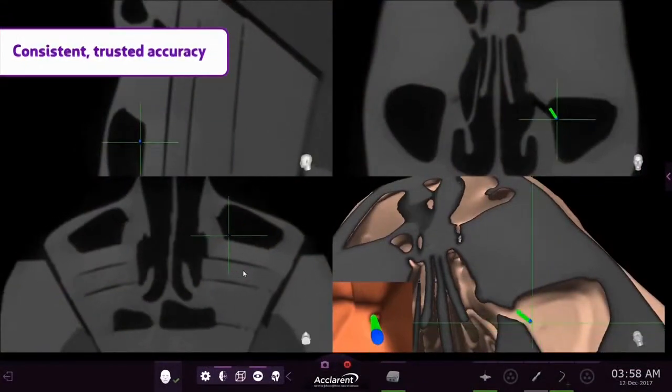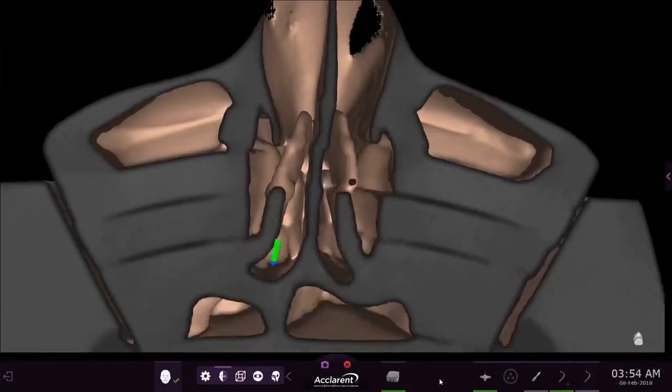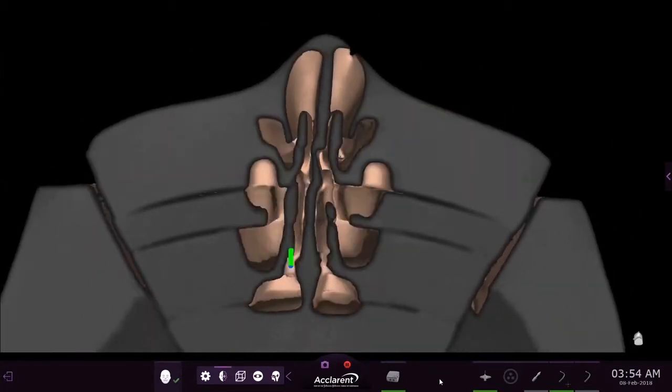So you know the normal anatomy. You've got an instrument that will guide you, knowing the anatomy plus the CT scan that's three-dimensional, will tell you what sinus is. All of them? It'll target the specific sinus. The CAT scan will tell us, is it frontal, is it ethmoid, is it sphenoid, is it maxillary, and which side is it on? So we can guide ourselves right into that specific sinus.